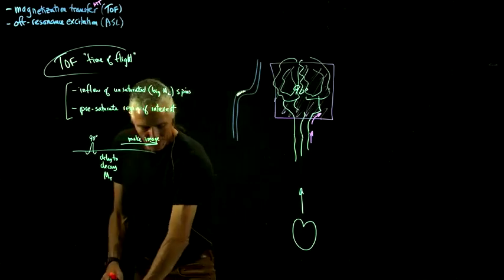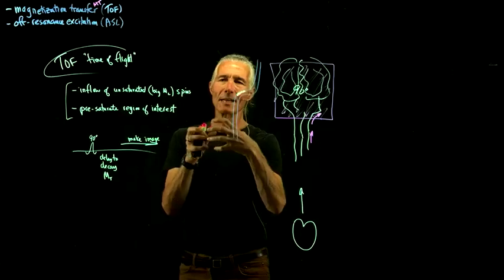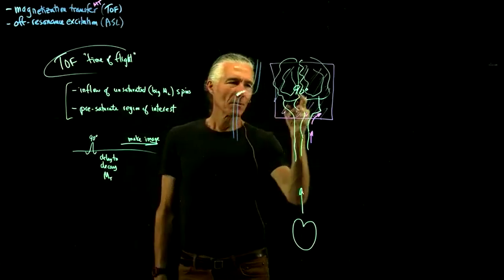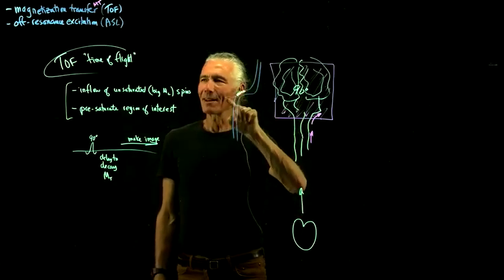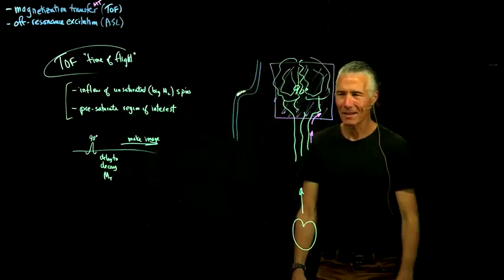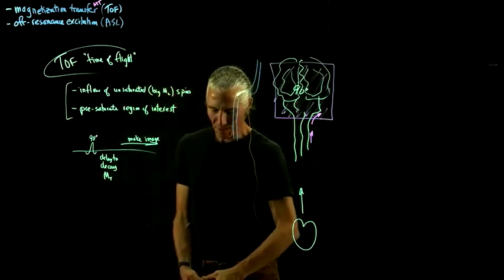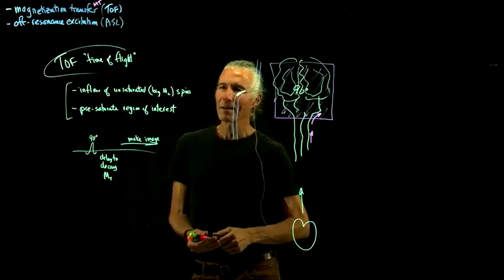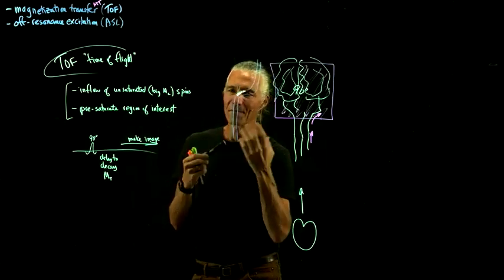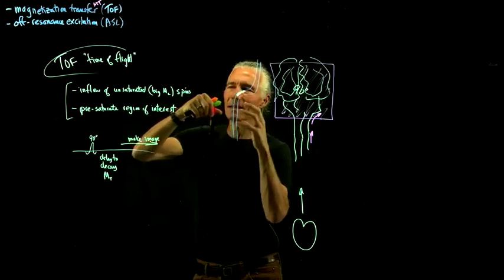Now, if you've ever looked on the scanner, what do they do with that image? You can immediately turn it into a rotating 3D picture of these blood vessels, and you can look for little crud, see if there's any crud built up there without doing any X-rays. And so how do they make that image? It's a very simple kind of algorithm for making that 3D image. At first, you would think there would be some high-powered computation to reconstruct that image in 3D so that you could actually move it.